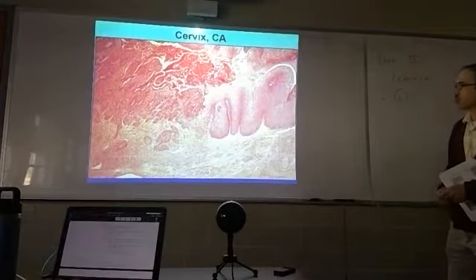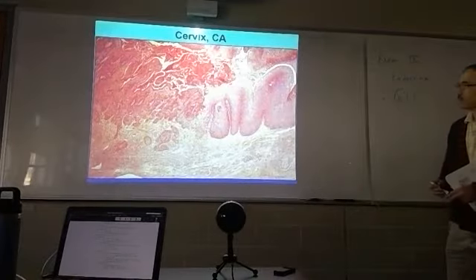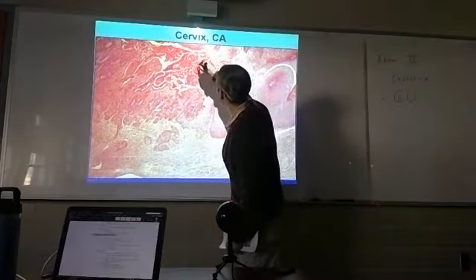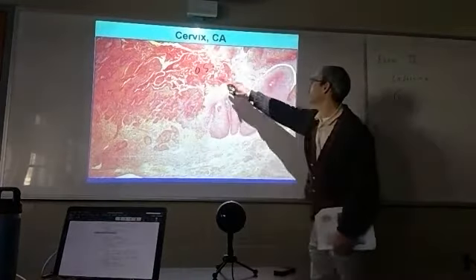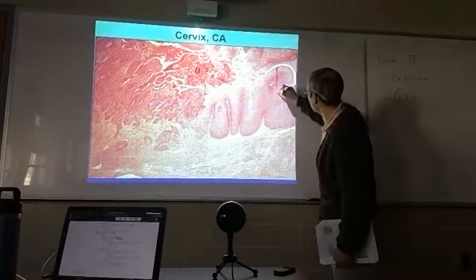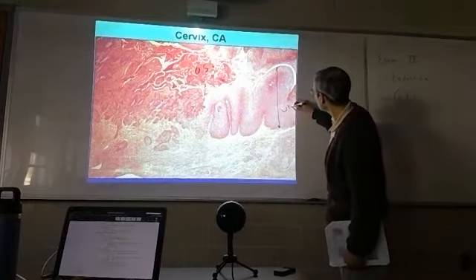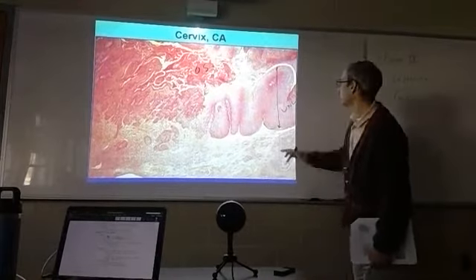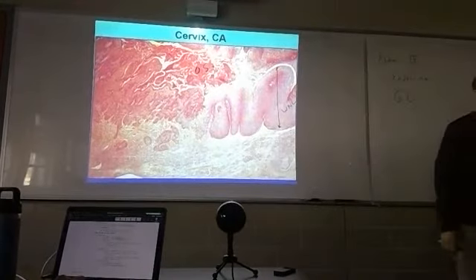Here's another section through a cervix. Okay, the cervical os is right here. It's kind of filled in with some keratin. We've got some normal epithelium here. And remember, we've got a basement membrane running right down here. So we look at this normal epithelium.